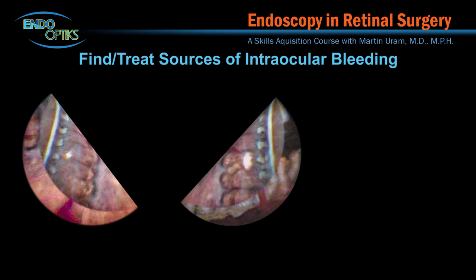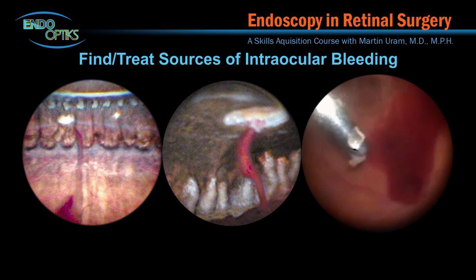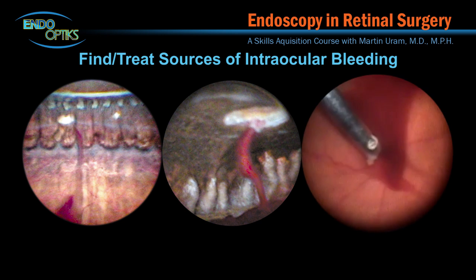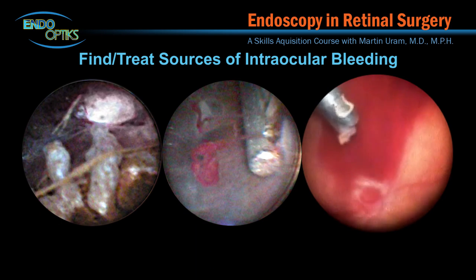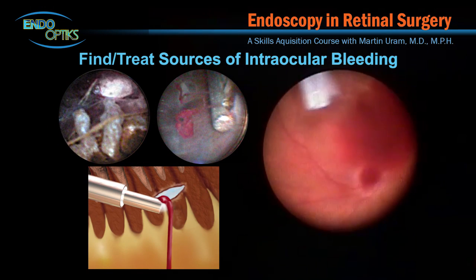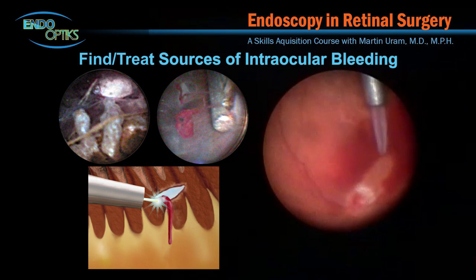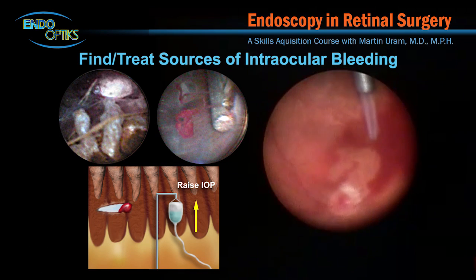It is not uncommon during the course of vitrectomy to experience intraocular bleeding, the source of which may be elusive. This one-handed technique is quite effective in rapidly identifying the source of the hemorrhage, particularly if it is emanating from an anterior site. Once located, the surgeon has a few therapeutic choices: using intraocular wet field, using laser, direct pressure with some instrument or even the endoscope, or raising the intraocular pressure.